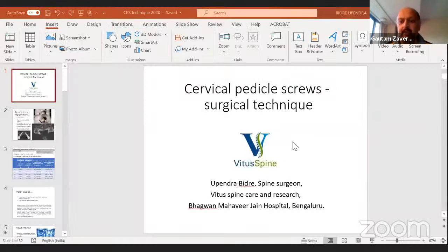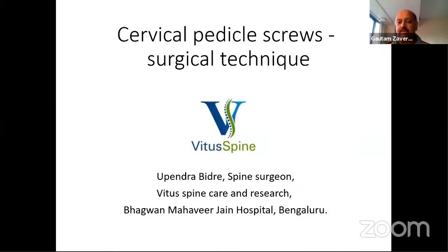So there are a number of questions on our YouTube channel for Ayush. Yes, please. Ayush, the first question that has come from Dr. Modi is, if you had to do a laminectomy, would you prefer to do laminectomy first or screw fixation first? So in most of my cases, as I showed you, this is a case where we did laminectomy. But first, I will try to put my screw.